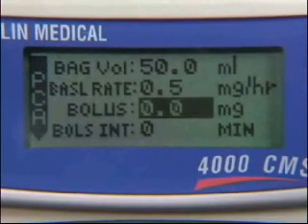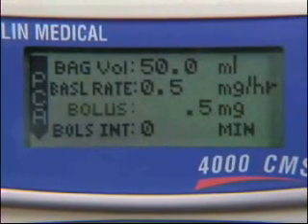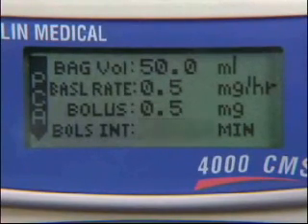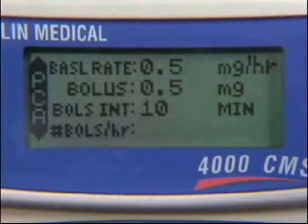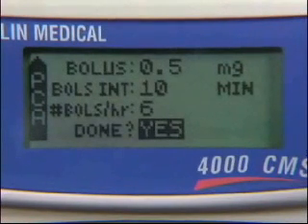The next line is the bolus line — this is the patient-activated dose. Enter the bolus amount and press the Yes Enter button to confirm and advance. If there is not to be a patient-activated dose, then confirm zero. If you have programmed a bolus, you must program an interval. Use the number keys to enter the interval time and press the Yes Enter button to confirm and advance. Use the number keys to enter the bolus per hour and press the Yes Enter button to confirm and advance.